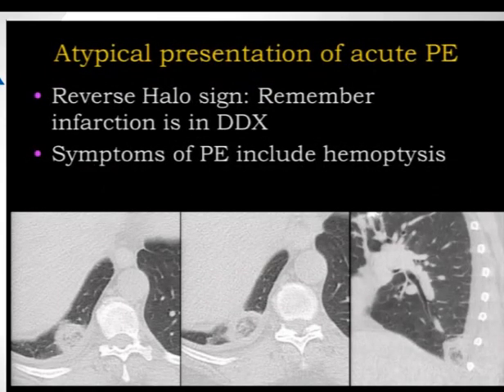There's a wonderful patient where I redeemed myself. There's a patient who had a right upper lobe wedge resection for an early stage lung cancer. Returned to the thoracic surgeons for a routine follow-up, but had symptoms of hemoptysis. The thoracic surgeon came in and just wondered what was going on, and I said, well, I'm quite convinced because the patient was not immunocompromised, I did not consider mucor, and she did not travel, so I didn't consider paragonimiasis. But I thought this could certainly be an infarct with a reverse halo sign, etc.